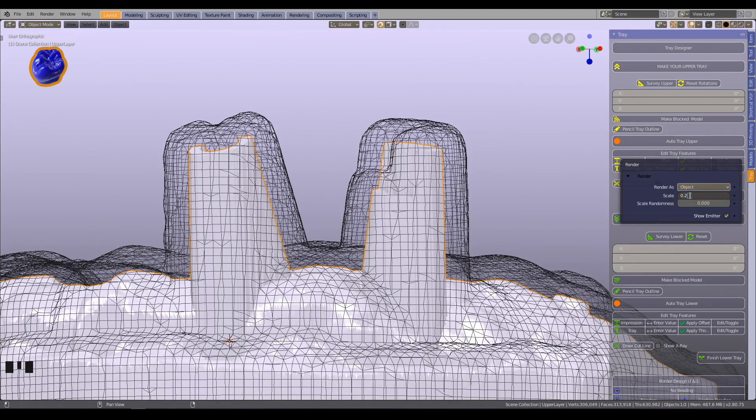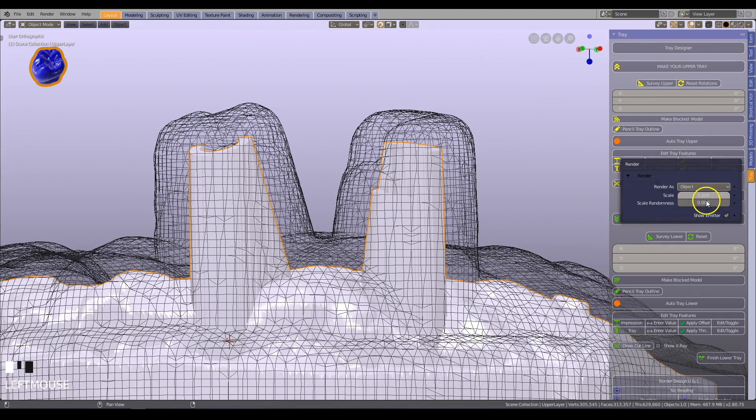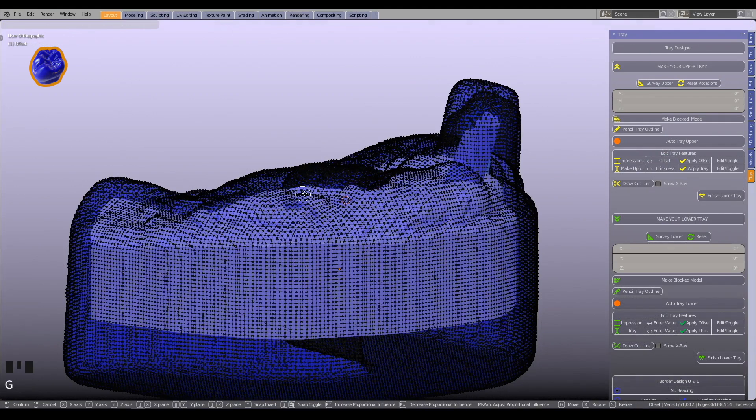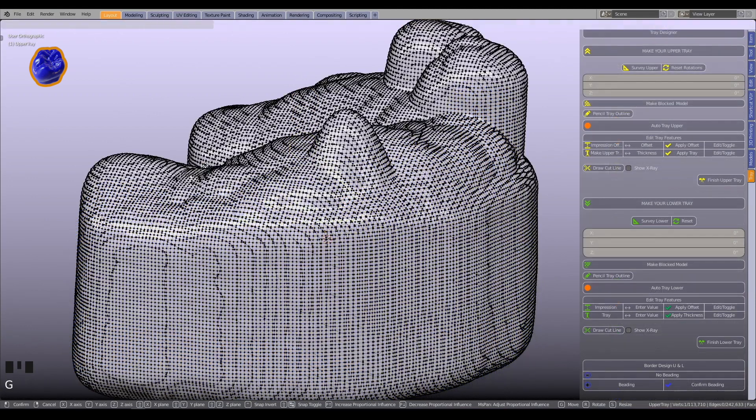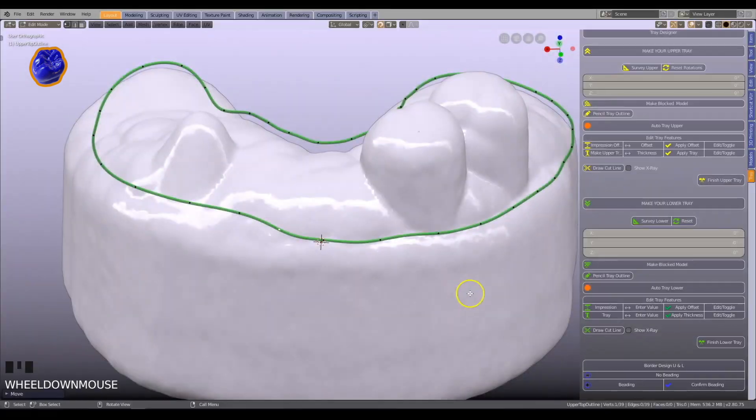Adjust the impression spacer where necessary, or you may want to change the thickness of the tray in some areas. The tutorials will show you how to work directly with the mesh.